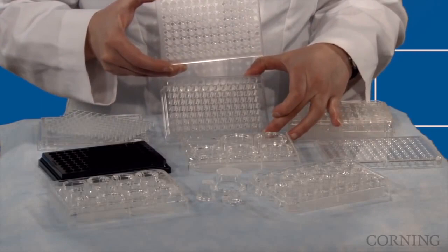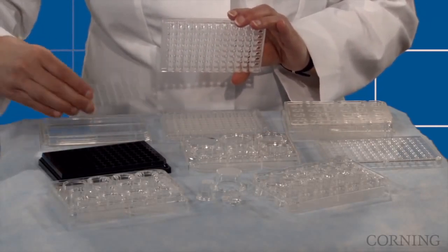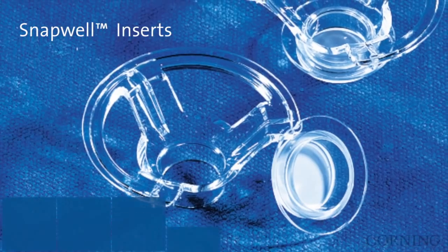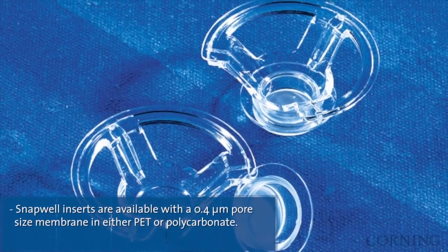HTS Transwell 96 units are offered with a 96 individual well receiver plate, available in clear, black, and white, or a single well reservoir with stabilizer grid. Snapwell inserts are a modified Transwell permeable support containing a 12 mm diameter membrane supported by a detachable ring and a 6 well plate.